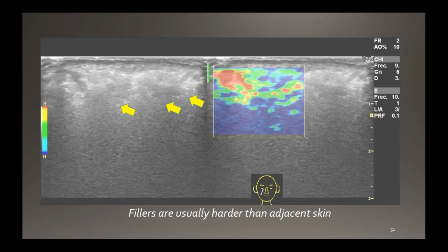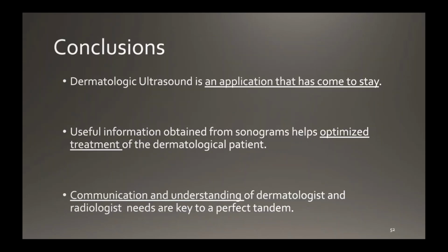And sometimes, as I've told you, we can detect some implants that were not so evident. To conclude, as you've seen, dermatological ultrasound is an application that has come to stay. You will start to see more publications, more papers regarding dermatological ultrasound, as there are more radiologists and more dermatologists doing it, and we have to collaborate to make the most of this technique.